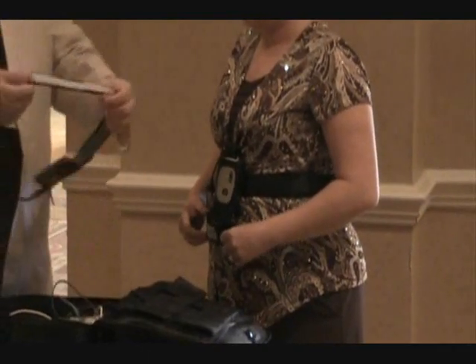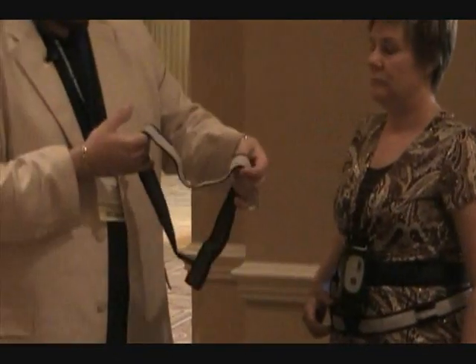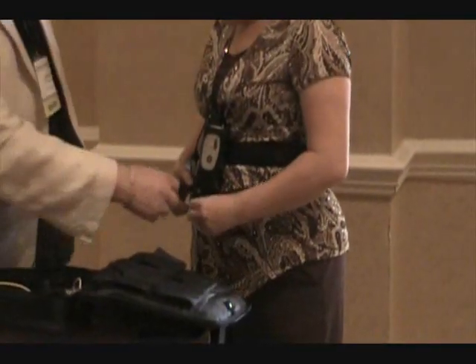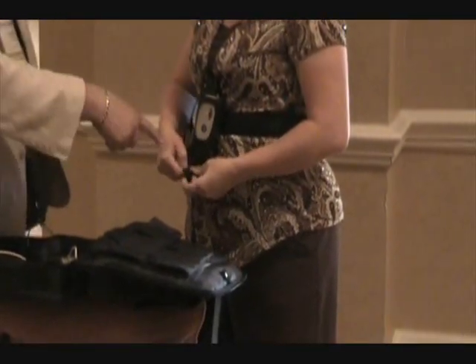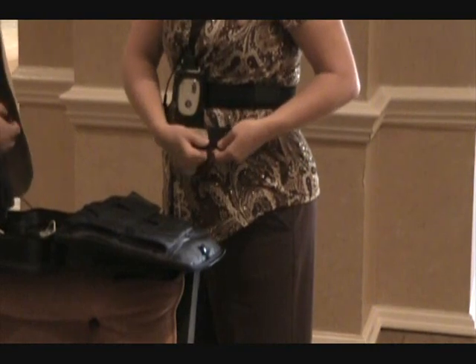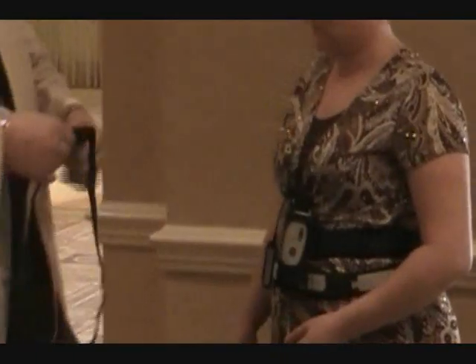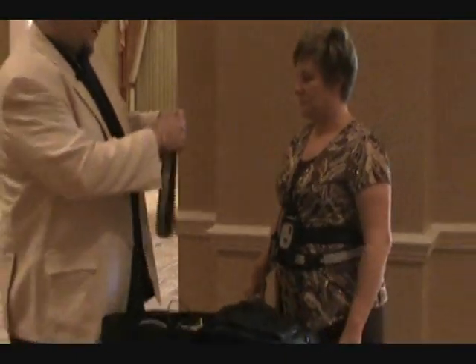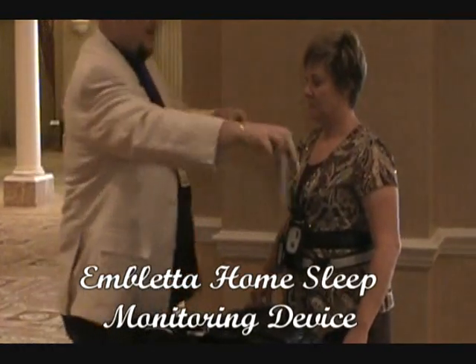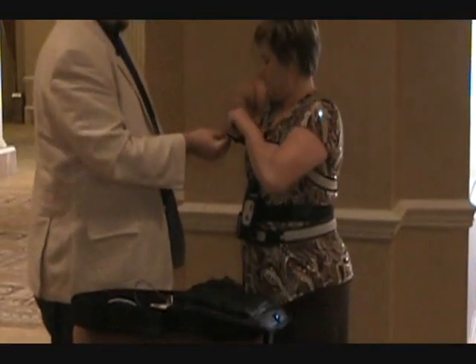It's important with these belts — you can see they're very stretchy — there needs to be some tension on them. Not all the way loose, not stretched to the max, just tight enough. If it's a little loose, take the velcro and fold it over onto itself to clip it, and that tightens it up enough so there's sufficient tension. We're going to do the same thing with the thorax belt — this one's already doubled over a bit — and it goes around and snaps onto itself.